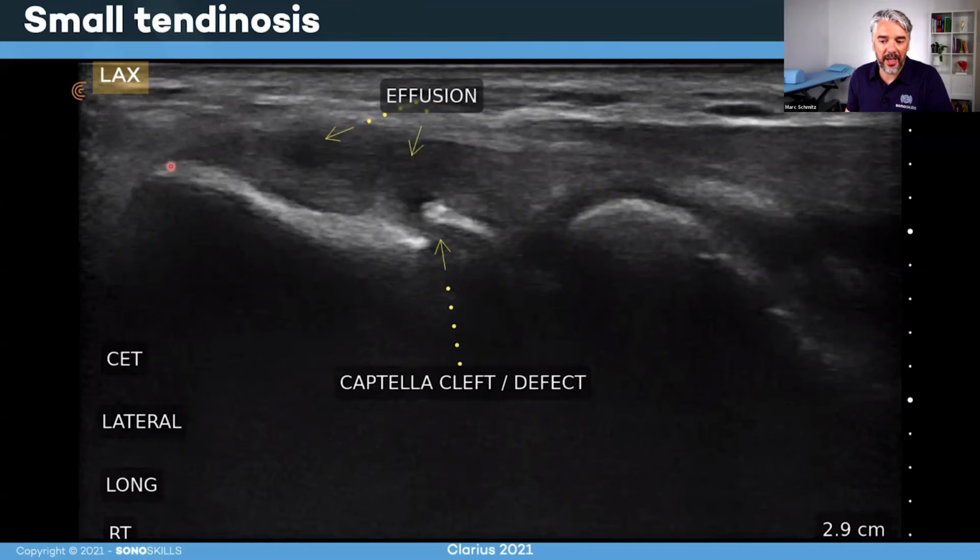Again, another case, we can see that the tendon has swollen again. This is a swelling. We can see also that the tendon is a little bit darker, more hypoechoic, and especially this spot is quite hypoechoic, and this seems to be a tendinosis. It's not tearing, I would say, because I still see some fibrillar pattern. You see some connection right there, but it's definitely swollen. Therefore, this thickening of the tendon, this convexity of the tendon, but also this hypoechoic appearance of the tendon.